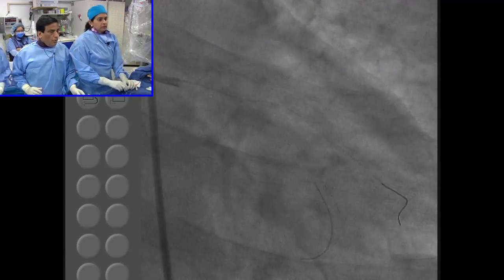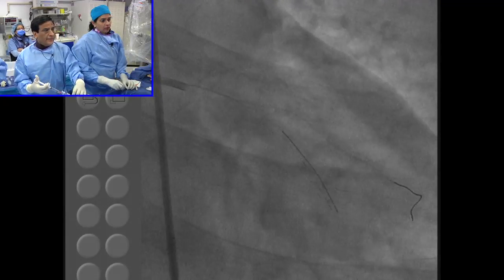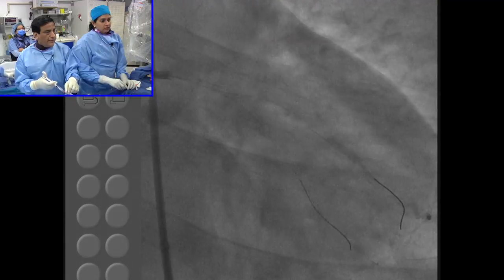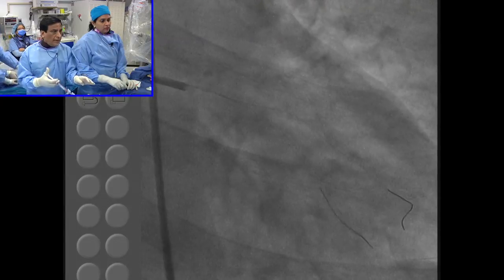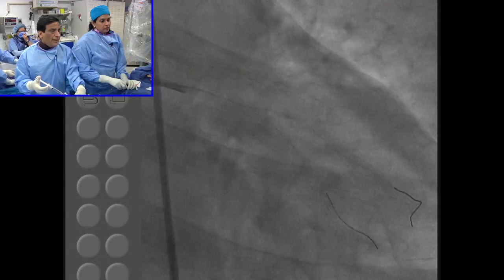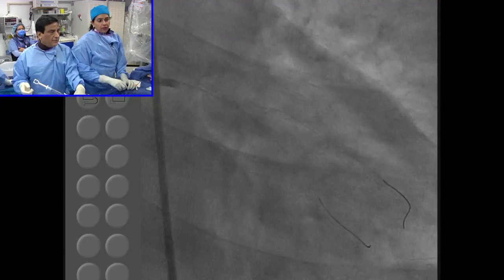Okay, now the more important thing is I think we need to take care of the distal vessel. Initially we were thinking not to do it, but that's a very diffusely diseased vessel. Maybe we'll take a better picture now. And if needed, we put a stent now, because clearly a stent through the bifurcation, which you can always go back, will make the procedure much more complex. So just like we had done one stent in the OM, we need to decide. Get that 2.0 balloon again.